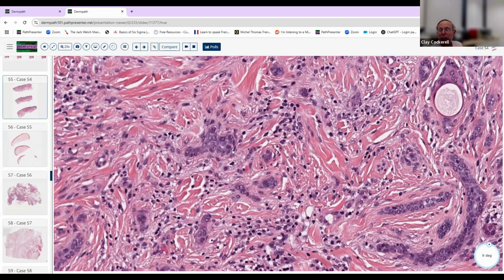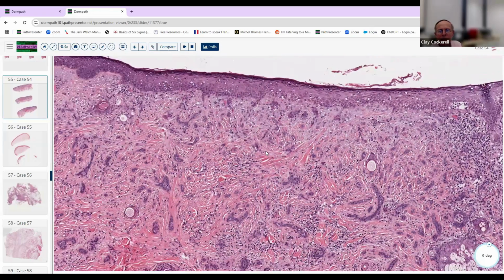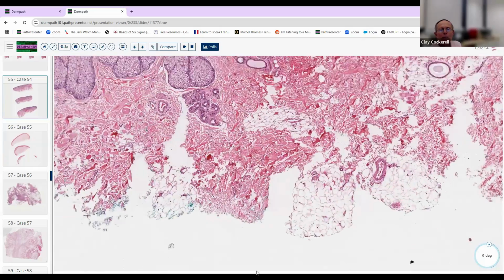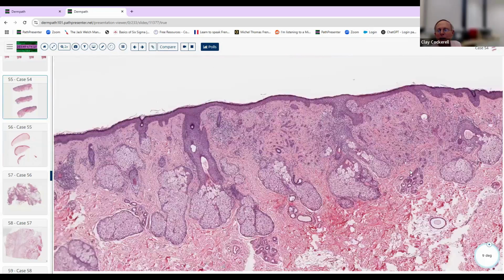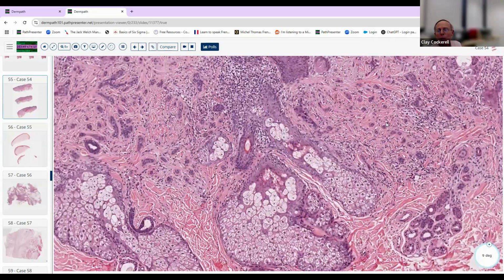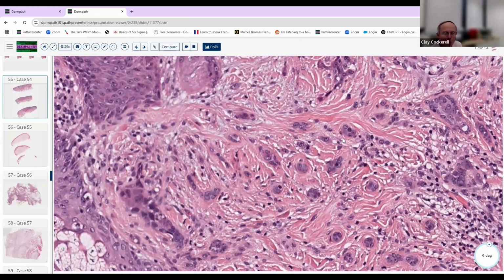They list microcystic adnexocarcinoma here as a choice, and I'm not sure that would be fair for this. So basically, recognize this is a sclerosing epithelial neoplasm. Usually if it's a basal cell, they're going to see a focus of obvious basal cell in one area or another. So here, this is thought to be morpheaform basal cell, but this could look very much like a microcystic adnexocarcinoma. So they're not going to do what we did to you on this question here. They're not going to ask you to distinguish between those two, because this really could be that.